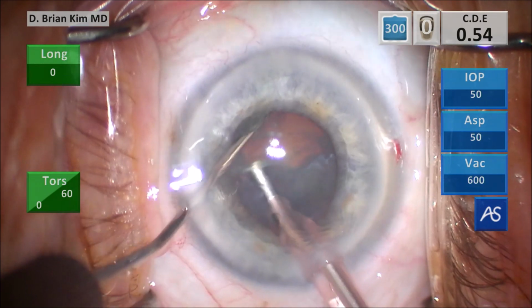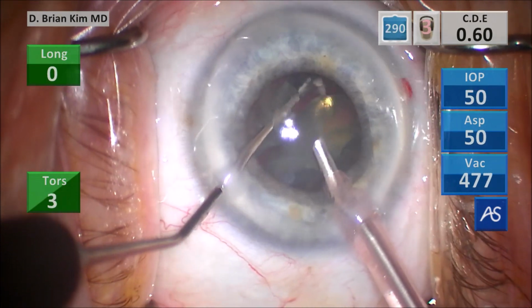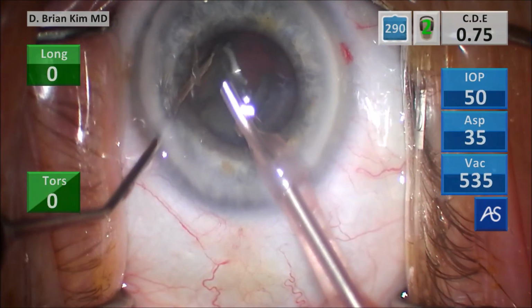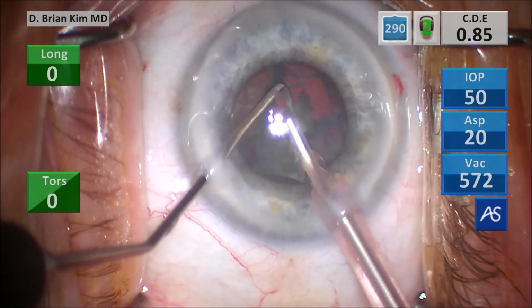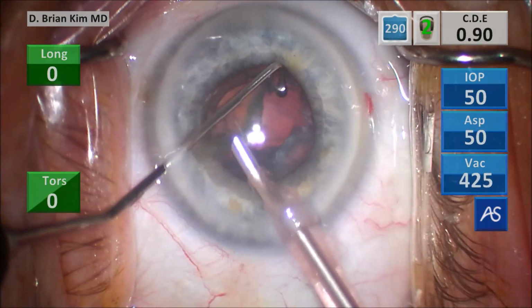Turning the second heminucleus in front of me, placing the chopper around the lens piece, pulling it centrally towards the phaco tip, dividing the lens in half, and then using some vacuum to grab that third quadrant, crushing the lens between the instruments, and then emulsifying the lens pieces. Again, this is a soft lens, and so really the maneuvers are quite easy.